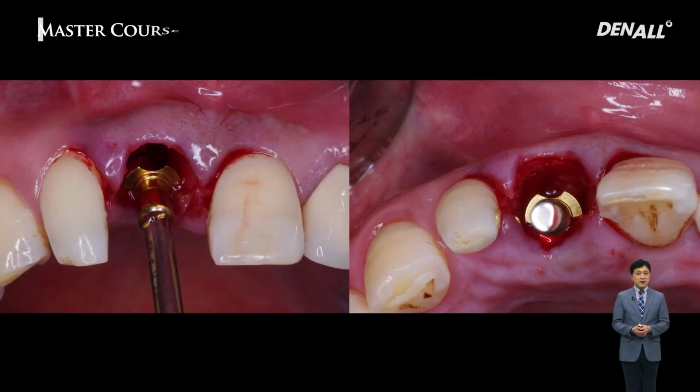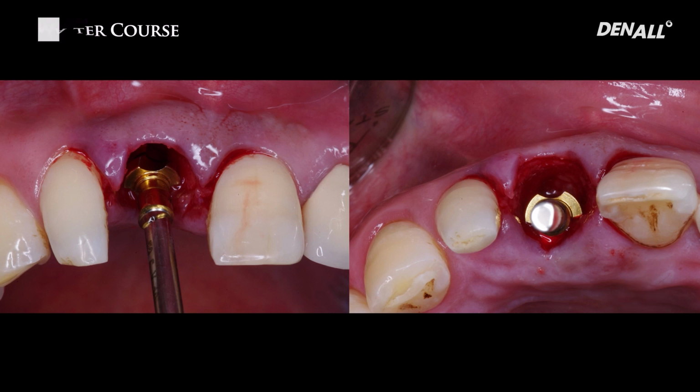After final drilling, the drill is inserted to check the path. In this patient, the drill is inserted to check the placement path. It's a little bit drilled toward the palatal side.